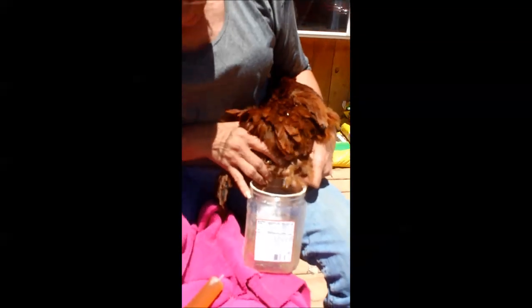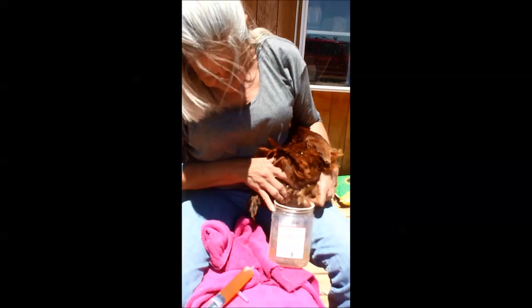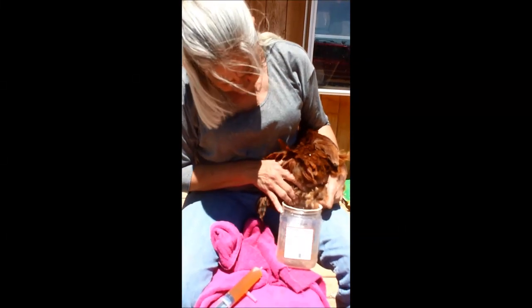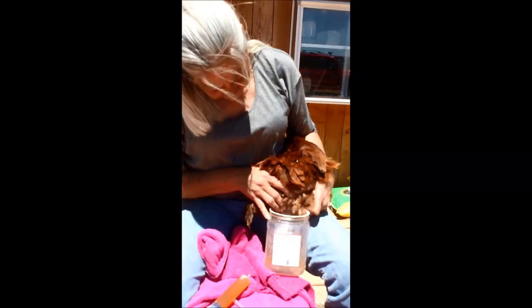So we're now going to just let this drip. Like I said, there are some people who will do this, and they will insert that needle into their chicken 6 or 8, 10 times. That's crazy. We wouldn't want to be poked with a needle that many times. So I got it in the syringe. I started the draw, and that way I know I've got outward pressure, outward flow. And now that I have outward flow, I've just disconnected the syringe, and this is coming through the needle into this container.